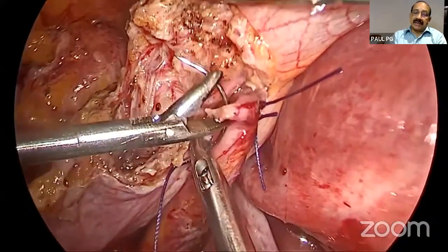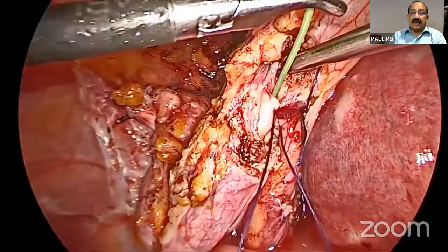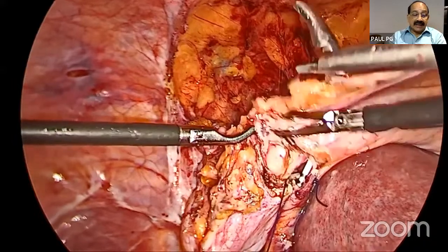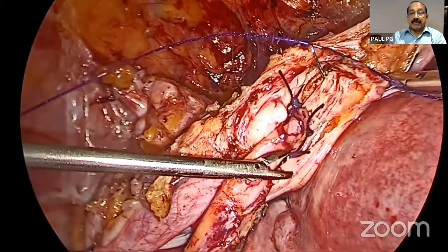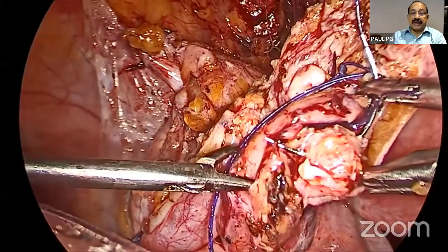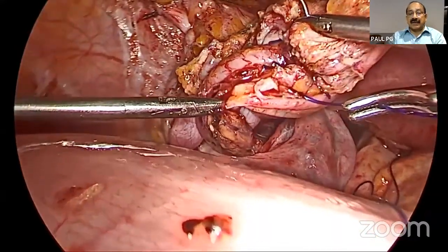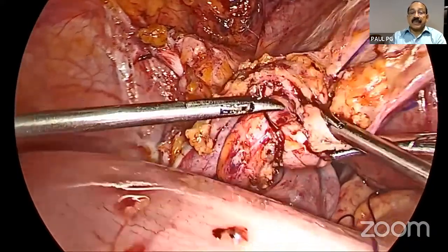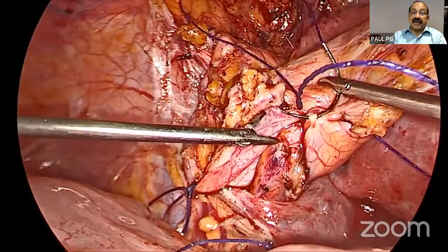We can use interrupted sutures. This is, I think, 2-0 Vicryl. And at this point, after putting 2 sutures, you put the ureteric stent and the anastomosis is completed. The second layer, the muscularis, is approximated over the ureter, making a small tunnel. Whether it's very essential is a debatable topic, but we want to reinforce the suture line and to reduce tension at the anastomosis.